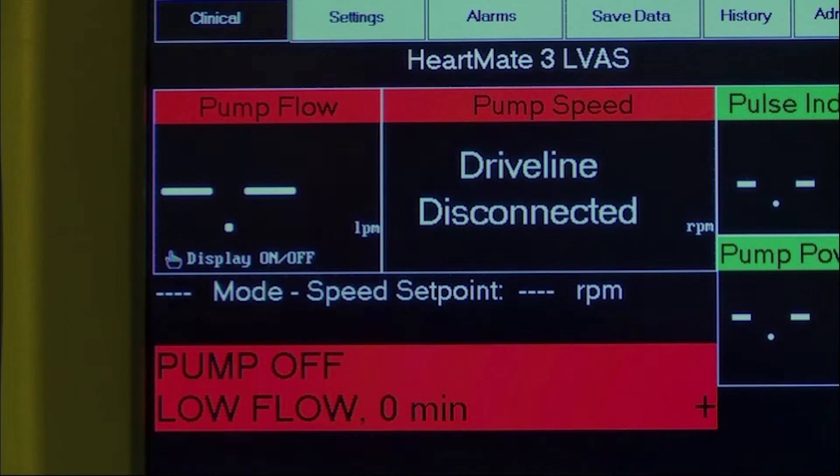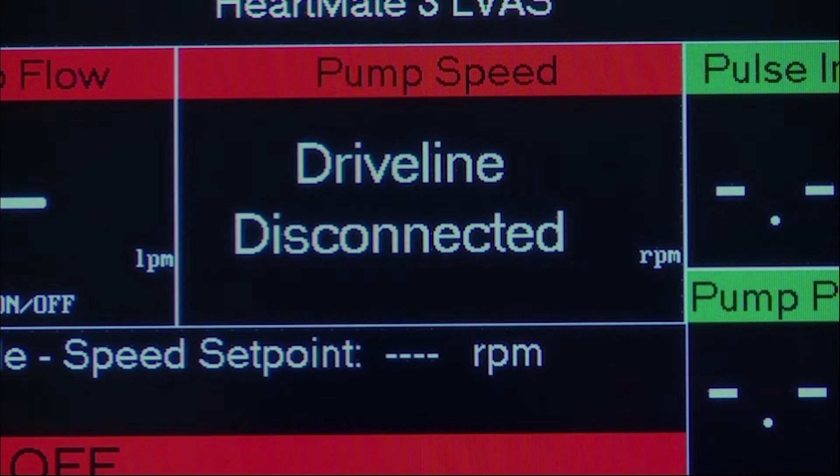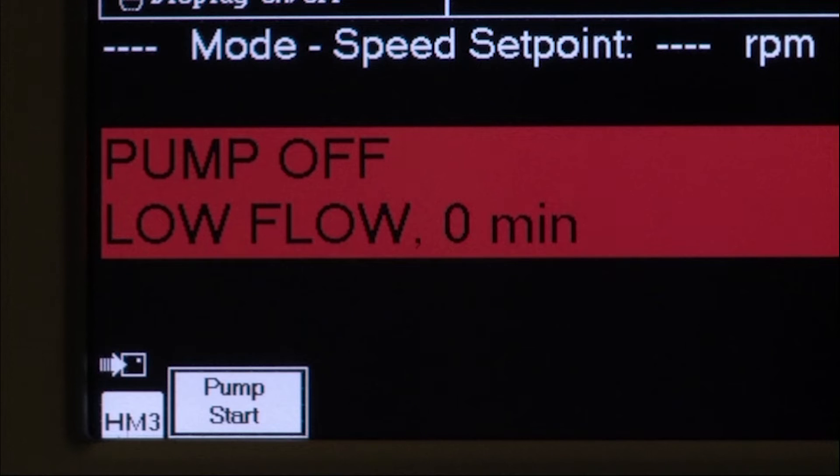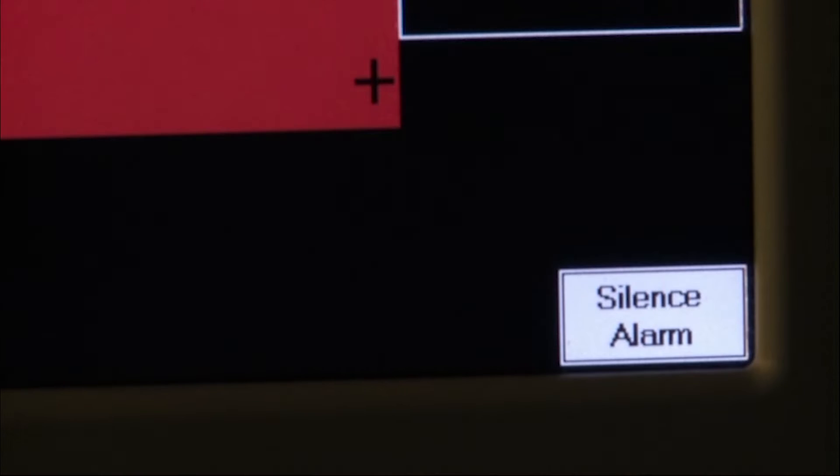The clinical screen display will indicate four dashes for mode and speed setpoint, driveline disconnected, pump off and low flow alarm messages, and two buttons: pump start and silence alarm.